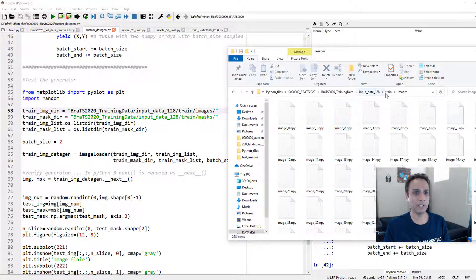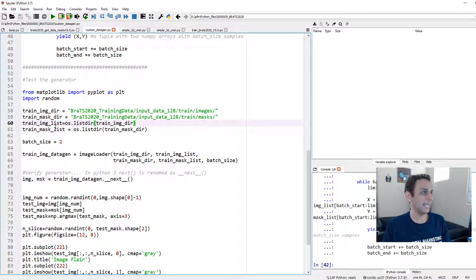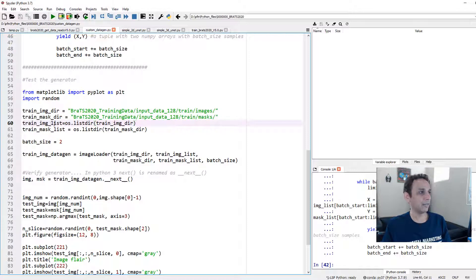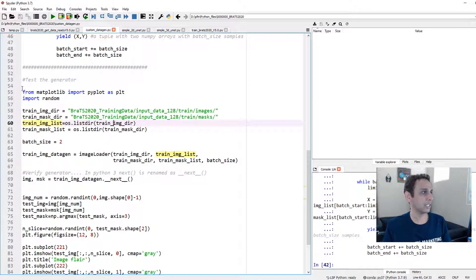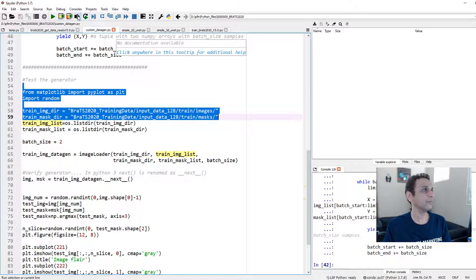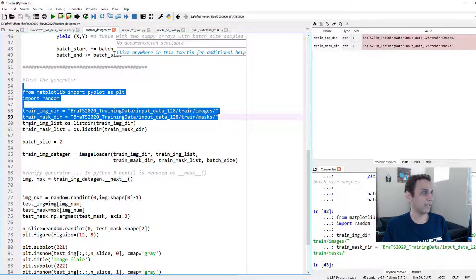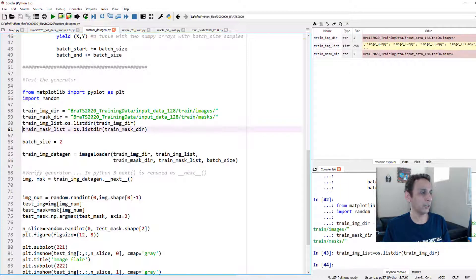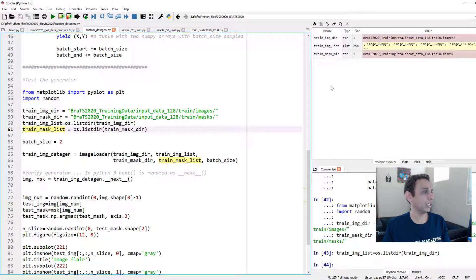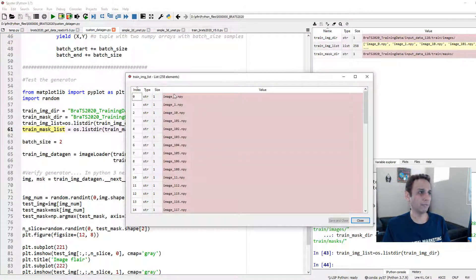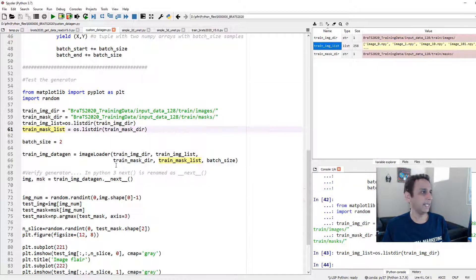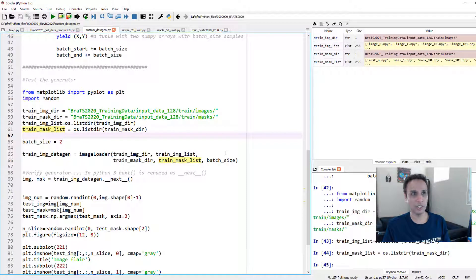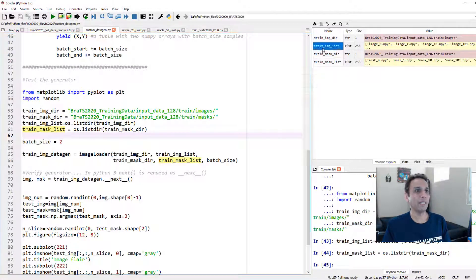Input_data_128, train, and images. This is where I have all my images, and all my masks are here. Then the train_image_list is nothing but os.listdir. So let's run these one at a time. There you go, my directory, and then my train_image_list is, hey, go into that directory and list everything. So that's what this is, os.listdir, and if you look up here, train_image_list, there you go, my file names.